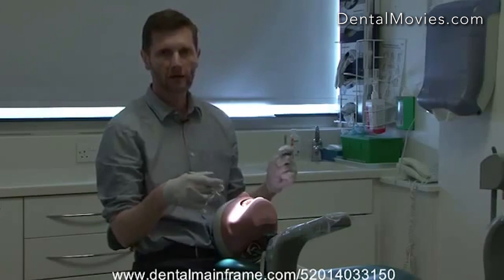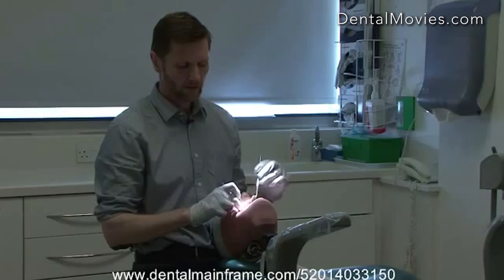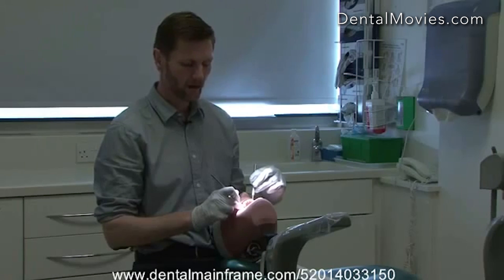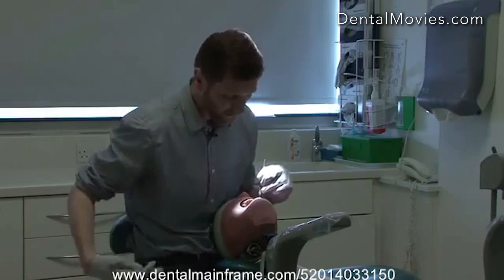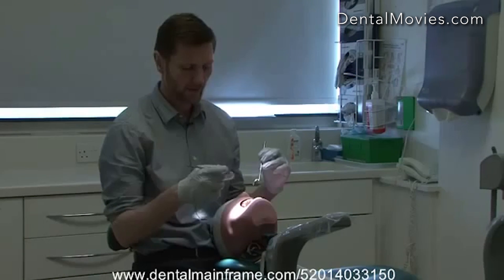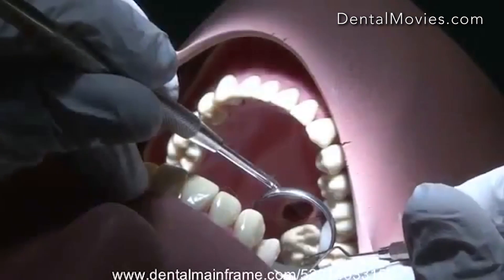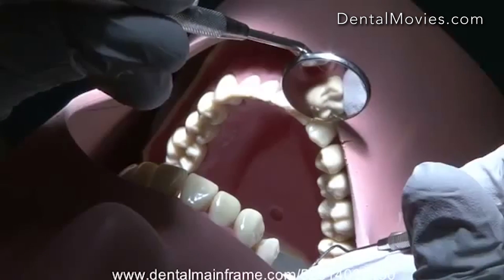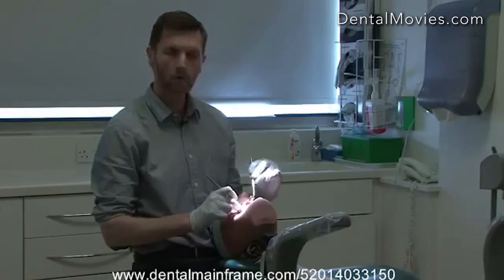When working with a mirror there are a couple of very useful techniques to maintain good vision. When looking at the occlusal surfaces of upper teeth and using a mirror while drilling, there's a tendency for the mirror to get sprayed with water, causing us to move the mirror away and try to maintain direct vision — which means leaning forward and putting more stress on the lower back. It's possible to hold the mirror at the right angle, move it out to the corner of the mouth, and maintain the image of the tooth in the mirror. I can see the occlusal surface of the upper first molar completely clearly, and this prevents the water spray from covering the mirror.